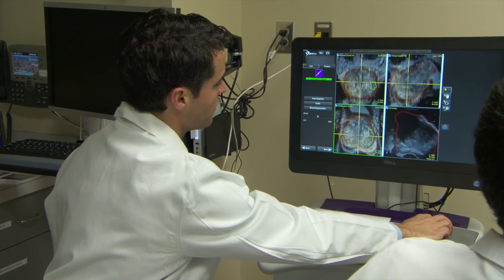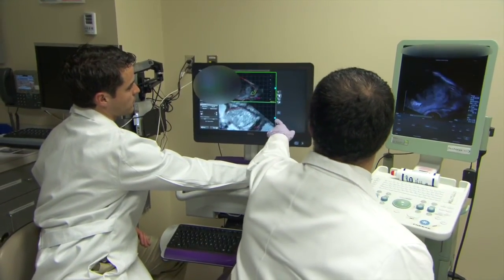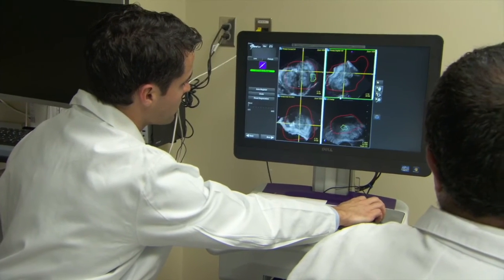One of the things I'd like to comment on as well, for those of you who are not urologists or patients who see this, is cost. People will see that we're doing MRIs for these patients and think, well, that has a great cost. And the reality is we'll often see patients who've had 4 or 5 prior negative biopsies that we'll pick up on the first MRI we do on them and 1 biopsy. Sometimes in these patients we'll just do 3 or 4 cores because they've had so many prior biopsies.